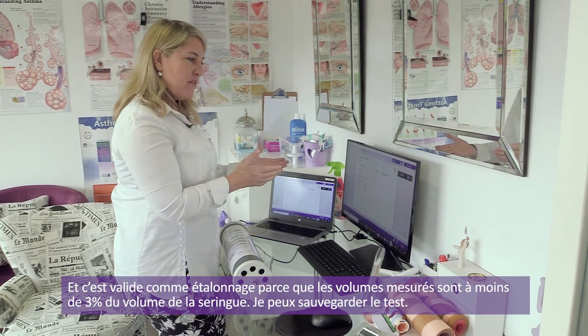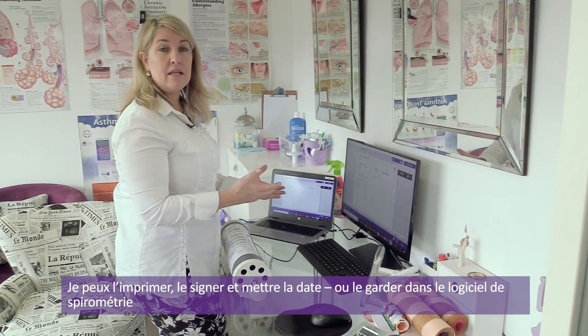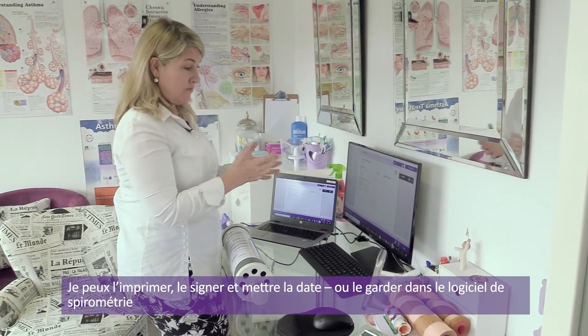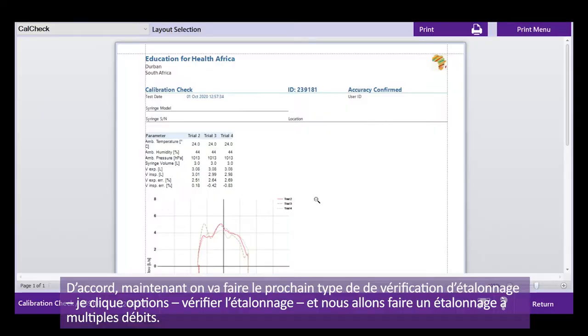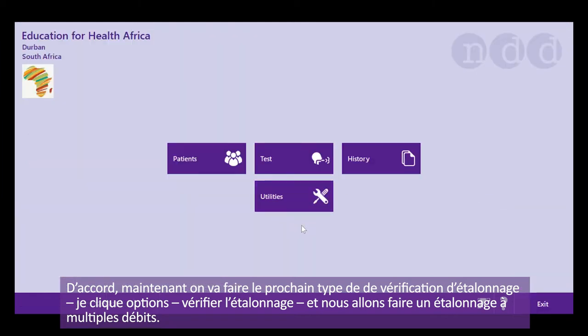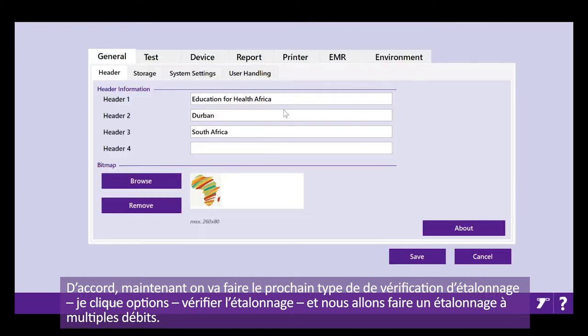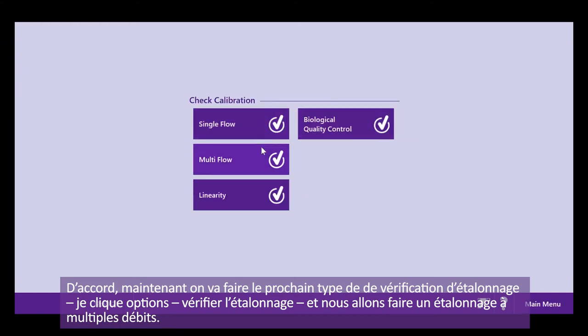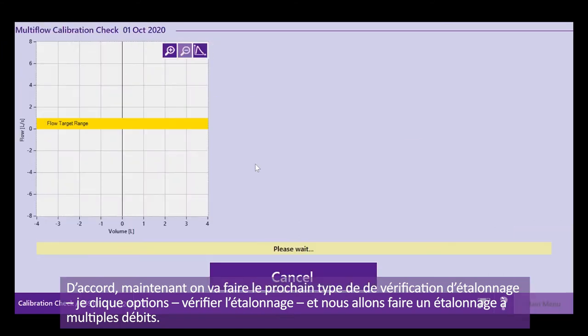I can now save this test — I can either print, sign and date it, or keep it in the software. Now I'm going to do the next kind of calibration check. I go into utilities and calibration, and we're going to do a multi-flow calibration check.